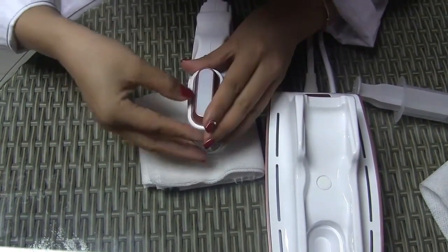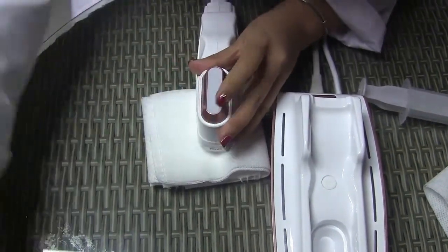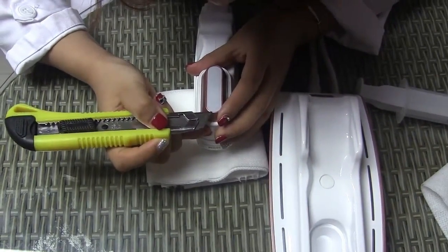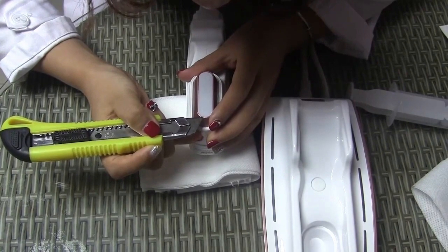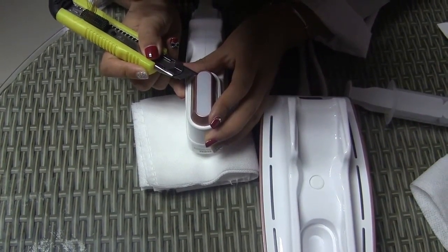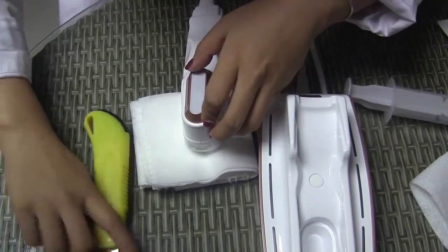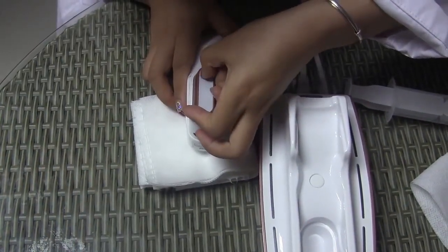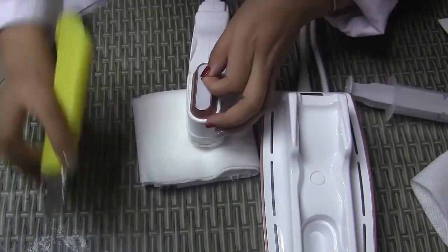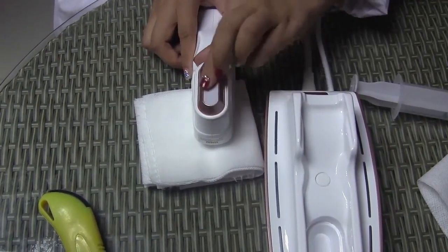Okay, now let's tear the protective membrane. If you cannot tear it off, you can also use something sharp like the knife. Remember to tear off this protective membrane, otherwise you cannot use it. Now you can use this machine.